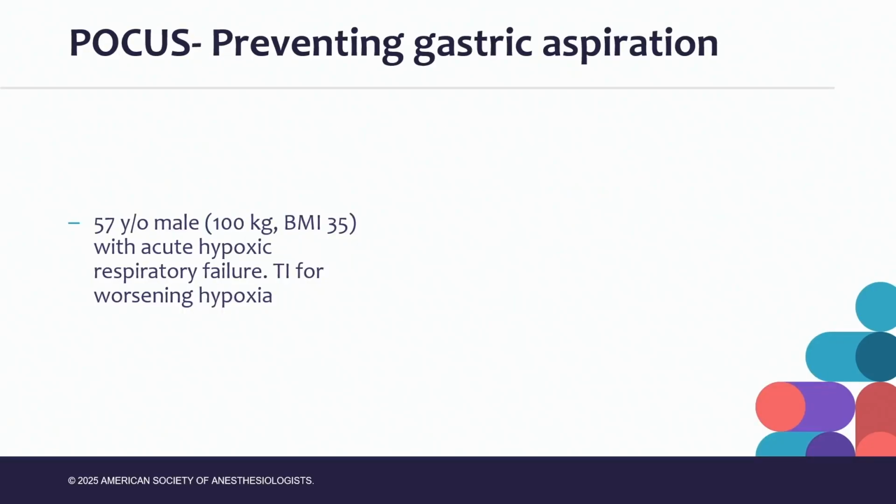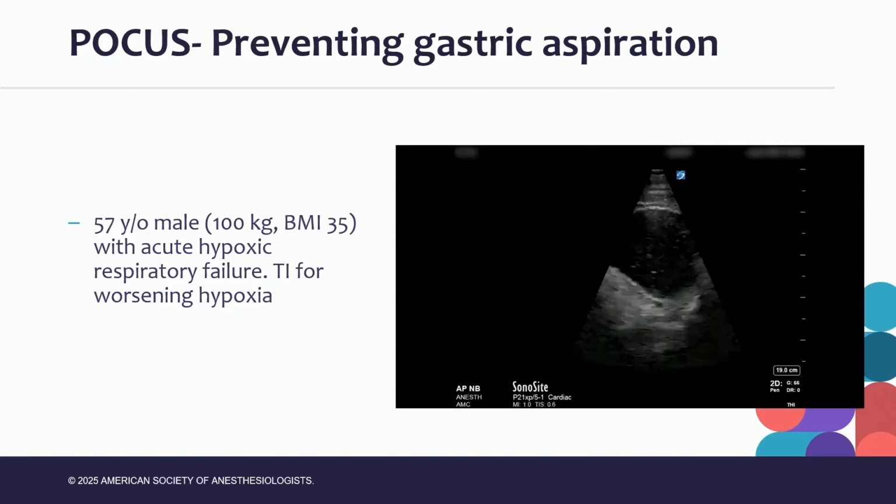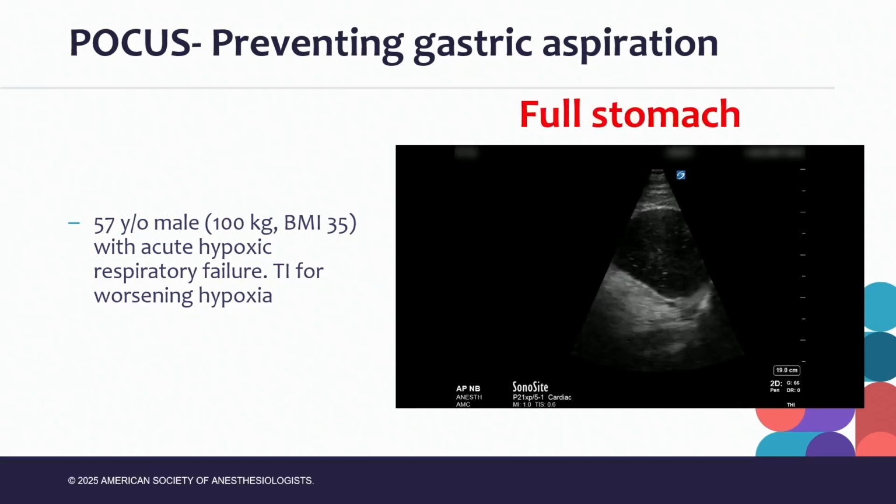Now, POCUS can also help prevent gastric aspiration. Again, you go in, you do a gastric exam, this is what you see. Again, if you have the option to drain this gastric fluid, it might prevent aspiration.